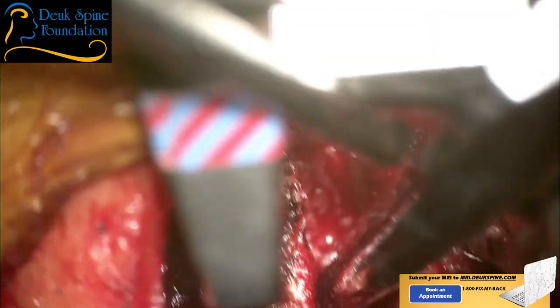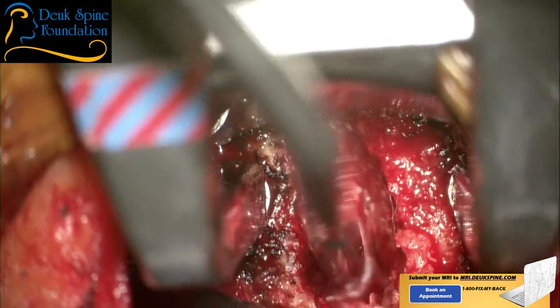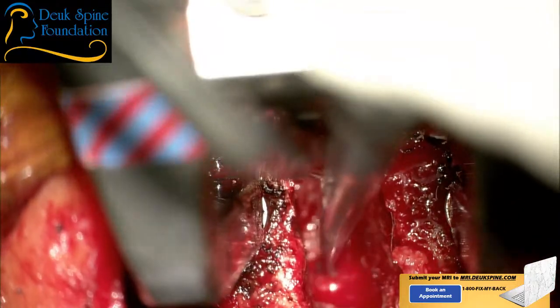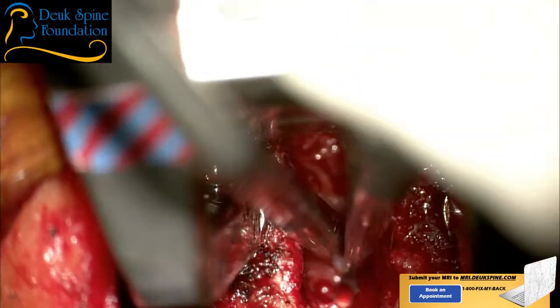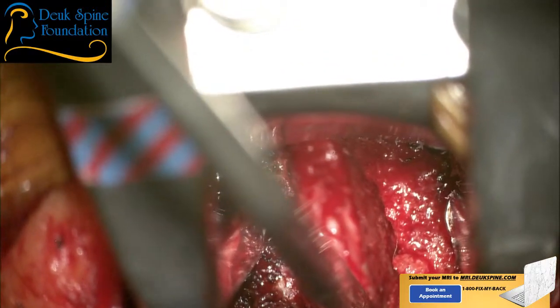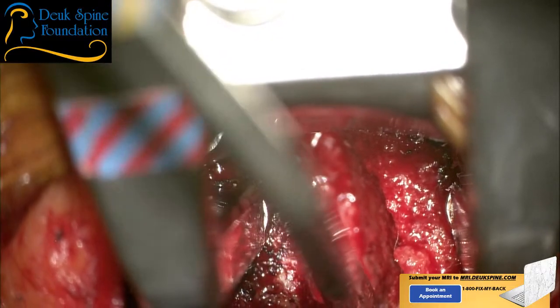Let me see here. Suck, suck. Let me just get one more bite. Let me see the curette too. So folks, that's the spinal cord and the nerve roots down there. All right, there's no pressure with that thing, but it's like a little shell of bone. I don't want to injure the root trying to get it out, but there's no pressure on the root. So it feels good. Gel foam? Yes, sir. Let's go. Gel foam cotton.